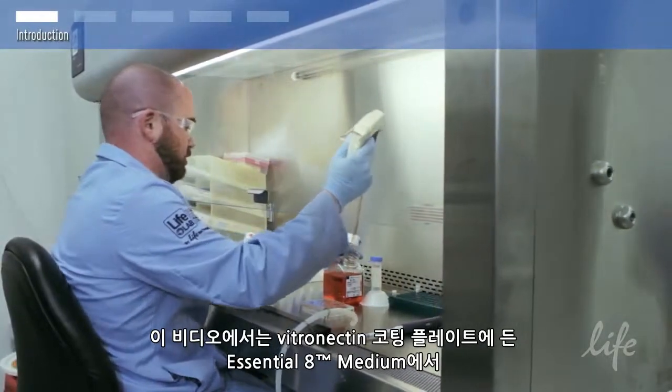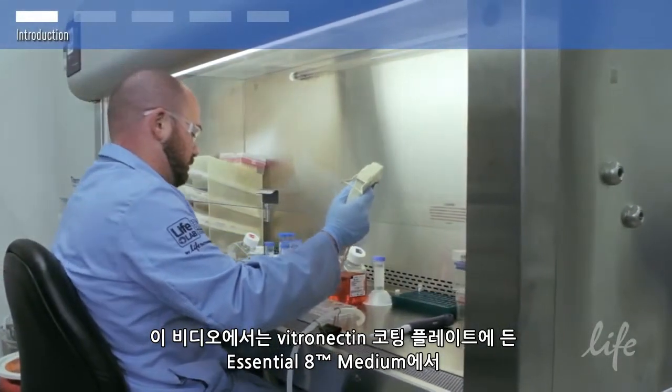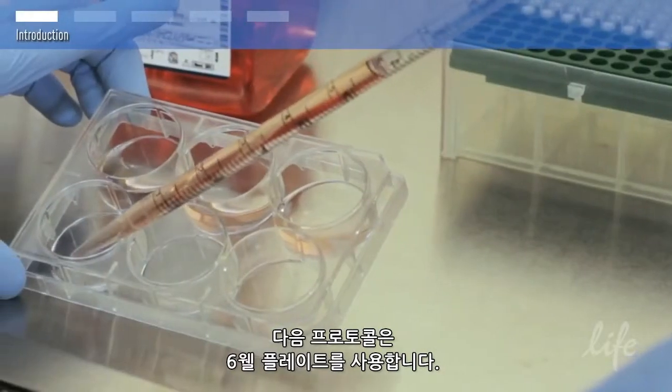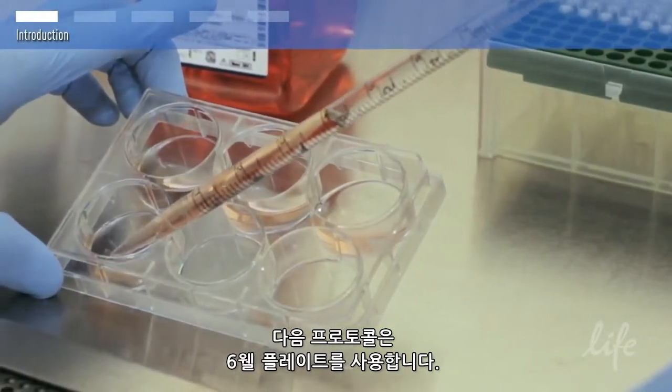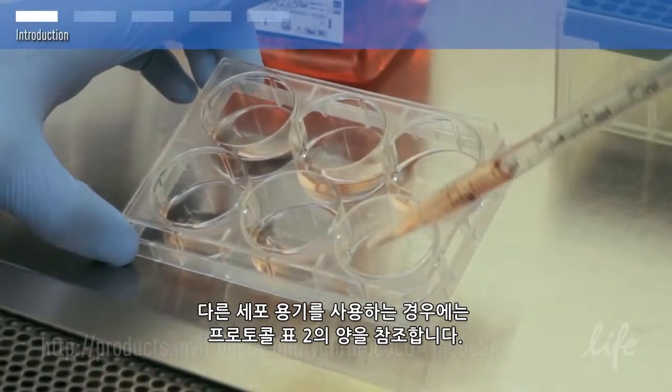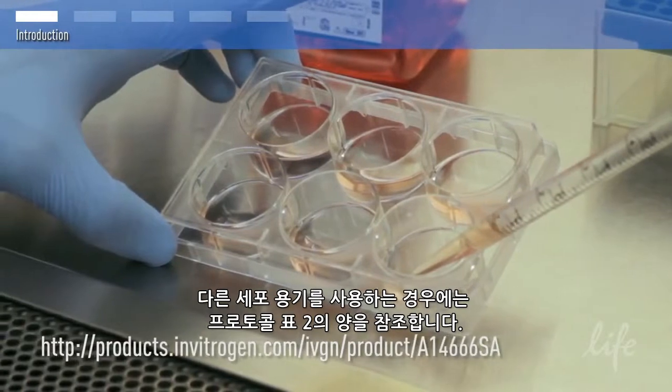This video will show you how to passage PSCs with EDTA in Essential 8 medium and vitronectin-coated plates. The following protocol uses a six-well plate. If you are using another type of cell culture vessel, please refer to table 2 on the written protocol for volumes.